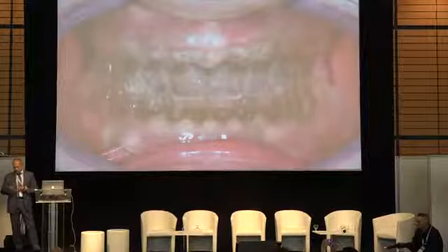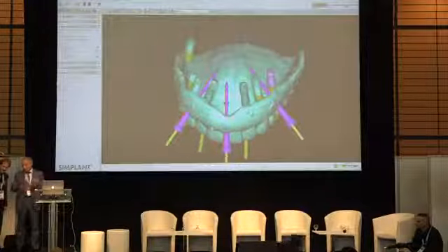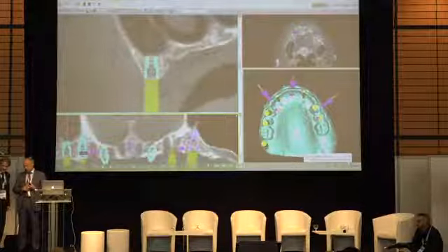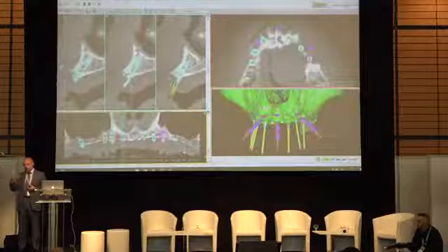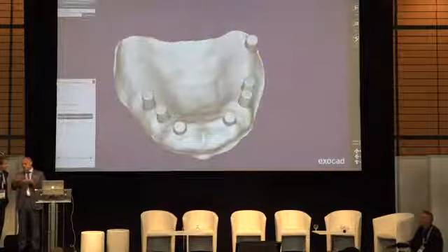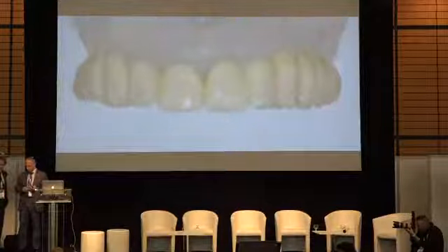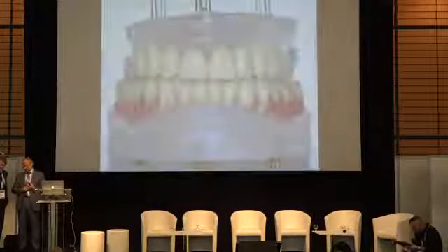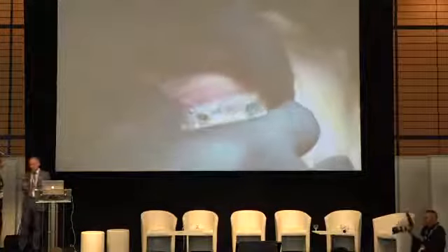So Uli created a surgical guide, we made an X-ray, and together with TeamViewer we created a nice position for the implants. It was not so easy. So we decided to put 8 implants in the upper jaw and 8 in the lower. With this technology it's really easy. So you prepare the temporary before we start. Surgical guides. So we try them in the mouth.